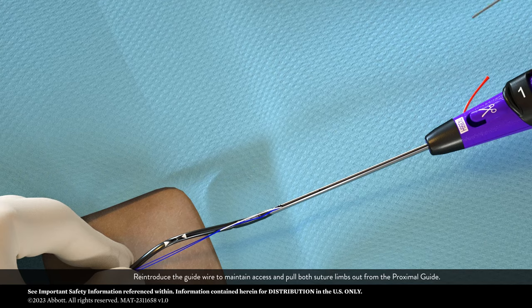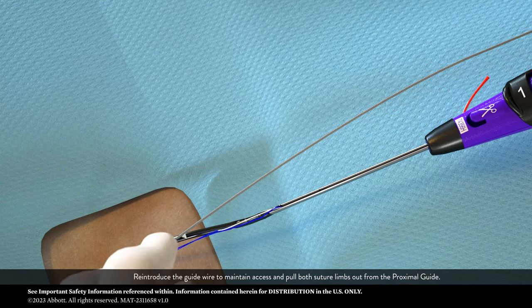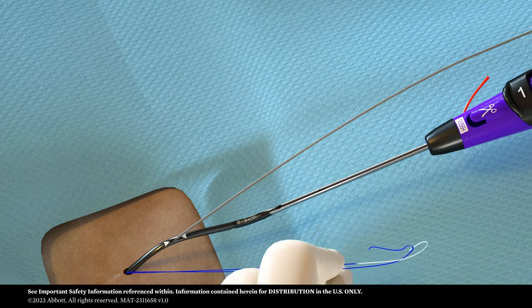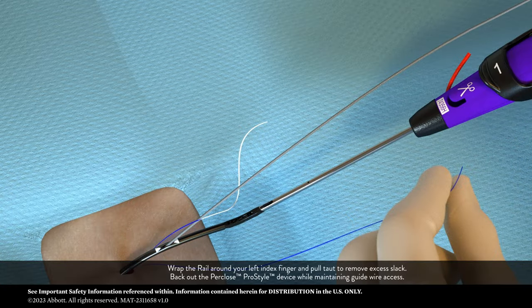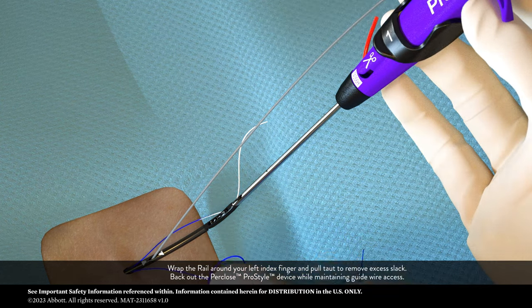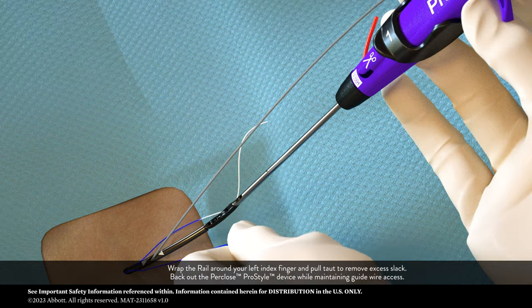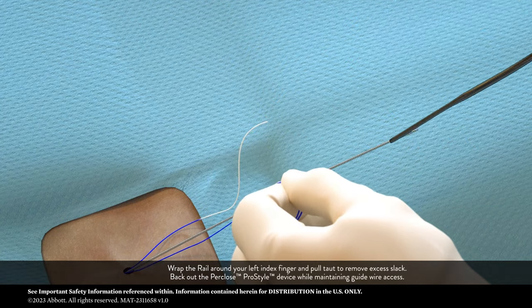Re-introduce the guide wire to maintain access and pull both suture limbs out from the proximal guide. Wrap the rail around your left index finger and pull taut to remove excess slack. Back out the Perclose ProStyle device while maintaining guide wire access.